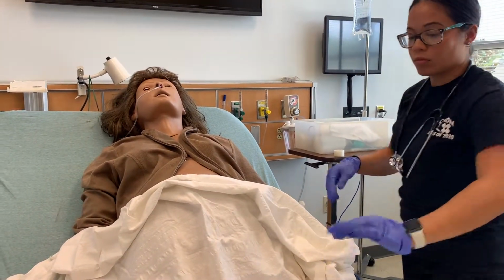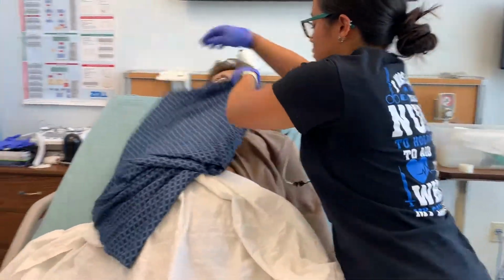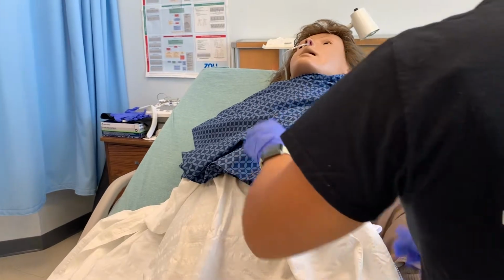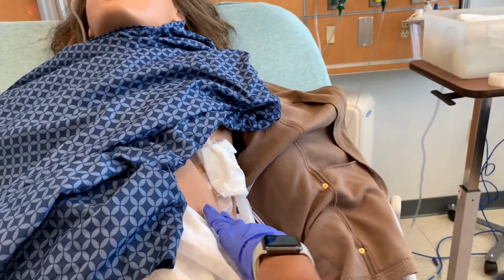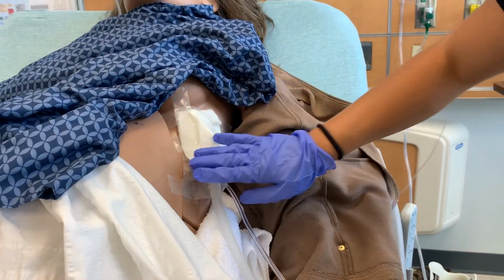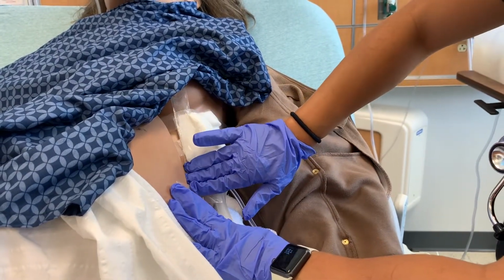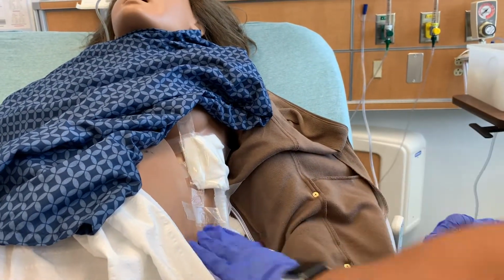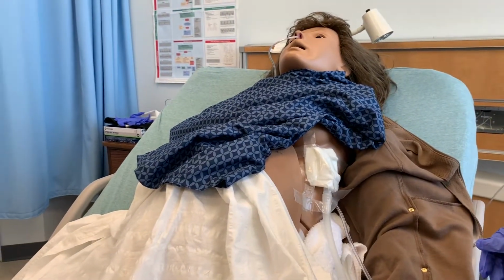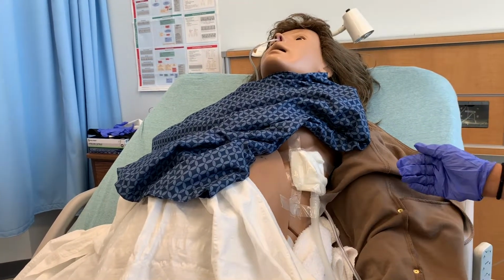Observe the dressing site. Inspect the dressing for excessive or abnormal drainage, such as bleeding or foul-smelling discharge. Palpate around the dressing site for crackling indicative of subcutaneous emphysema. Determine the level of discomfort with and without activity by asking the patient. Evaluate the impact of the changes to the patient's body.